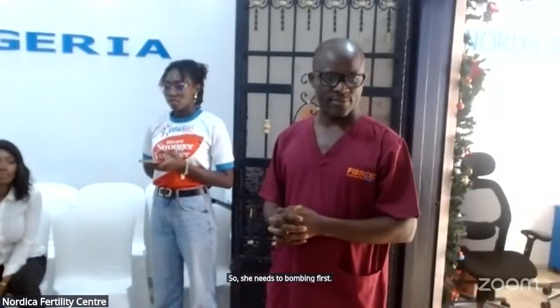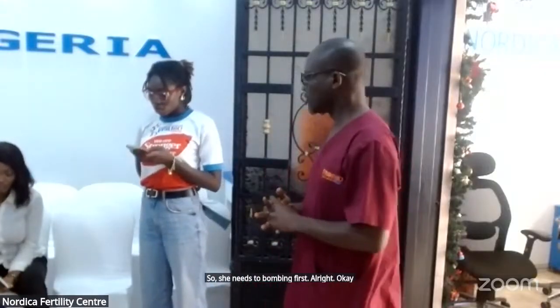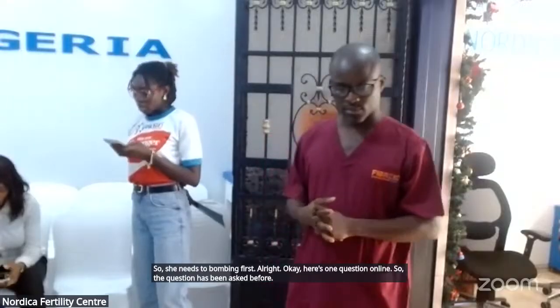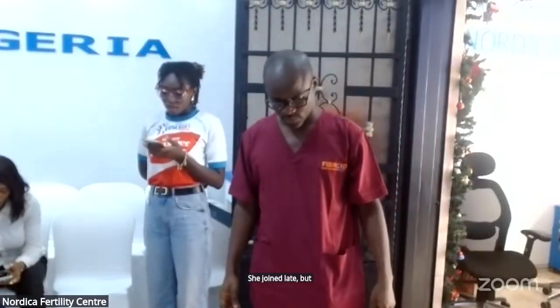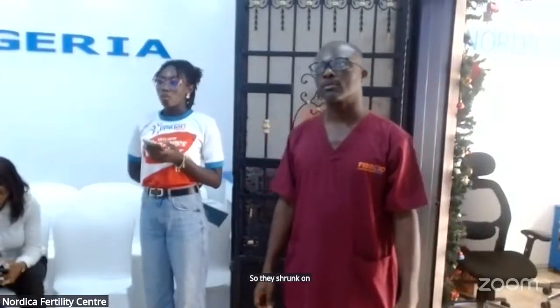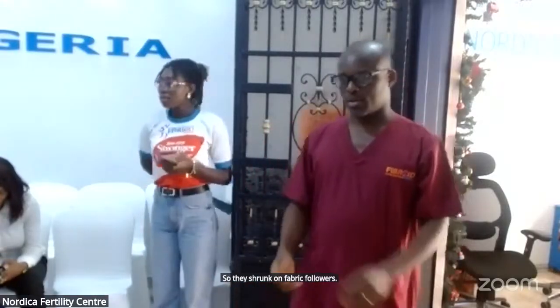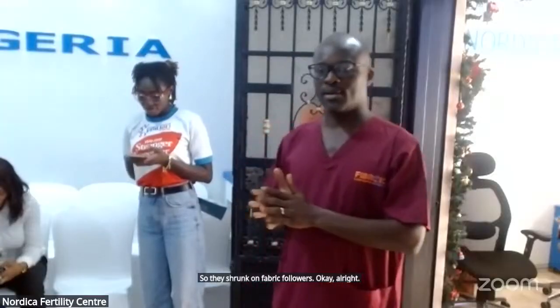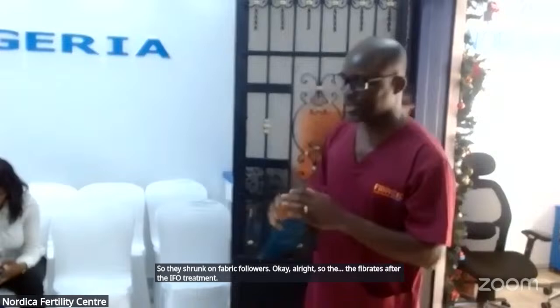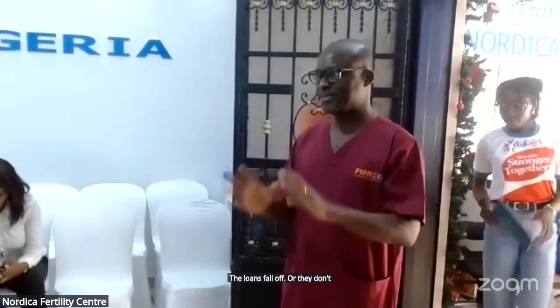All right. Okay, there's one question online. The question has been asked before, but she joined late. She's asking, after the treatment, does the shrunken fibroid fall off or what? The fibroids after the HIFU treatment don't fall off or come out with the menses.